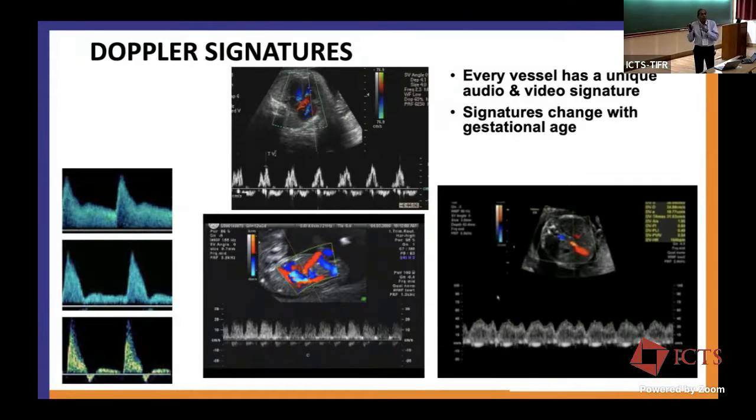So why am I saying all this? Because these are the images. For example, here, this is an image which I've got across the tricuspid valve. And this tricuspid valve shows you all the pressure changes inside the atrium.